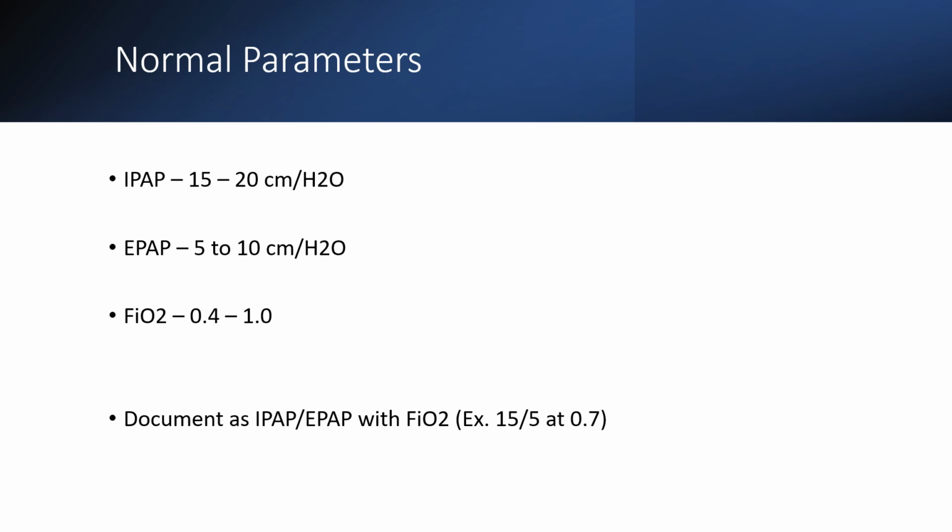Remember, as a review, it doesn't really matter whether it's BiPAP, CPAP, or BVMs. When you're applying positive pressure to a patient, that compresses the vena cava, applies pressure to it, and that reduces venous return, which in turn reduces cardiac output and blood pressure. Especially in patients who have vasodilatory or hypovolemic type diseases, they're going to be affected by positive pressure. It's going to have the most profound effect because the IVC will be the most collapsible in that disease process. Of course, it can cause hypotension in any of the patients.